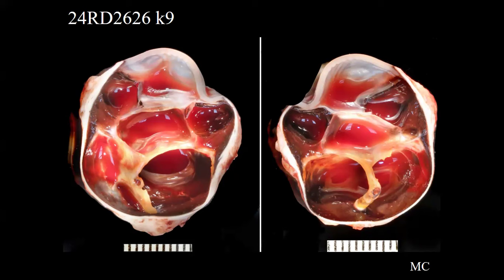So this is a 7-year, 3-month-old neutered male terrier mix. They describe in the right eye, which is the one we have, buphthalmus, zonules and ciliary processes are visible, which usually means that they're kind of stretched out. You shouldn't really see the zonules because they're tight from the front of the eye. The lens capsule is filled with blood, and there is no view of the fundus. So once again, we're kind of seeing a fibrinous sheet over the iris and lens capsule. So again, we're seeing stuff in the front of the eye, and then the posterior segment was hard to see.